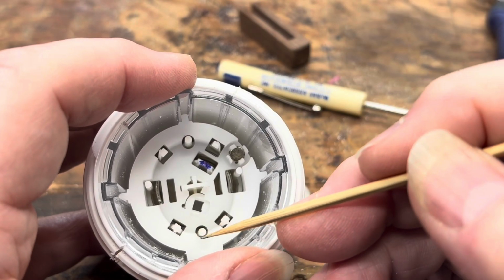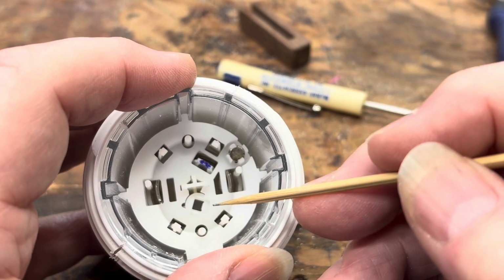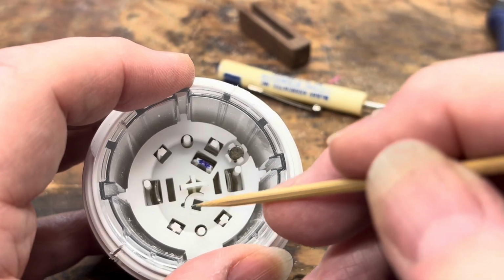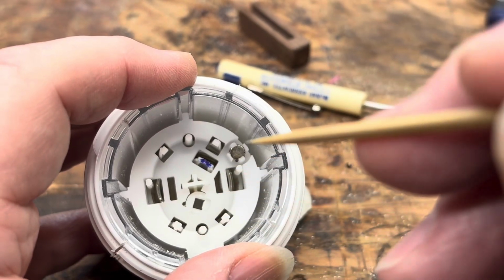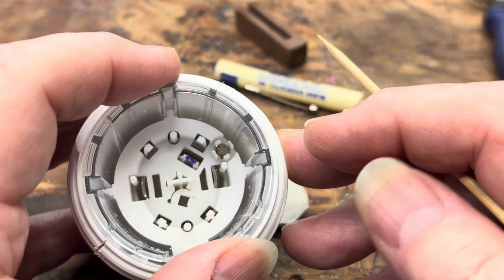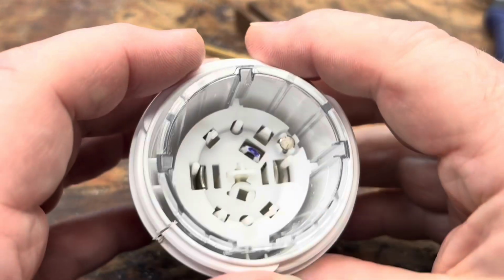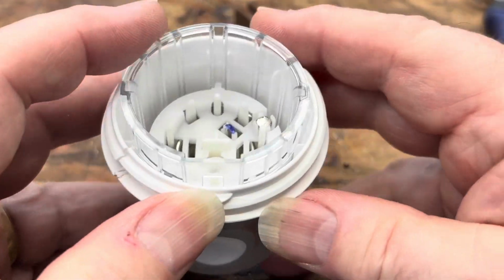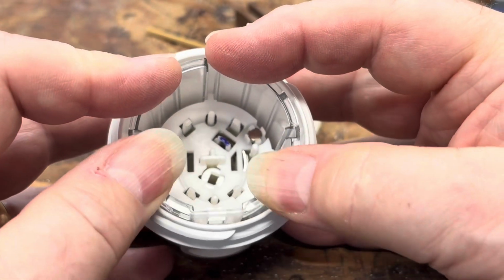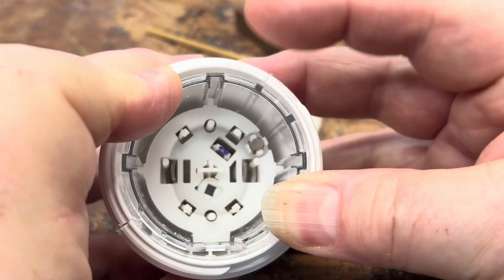Now that it's touching the patient's arm, we don't need to hold it in place anymore. By then, the needle has inserted the probe into the patient's arm, so we need to withdraw the needle. And then 4 shoots back into this cup assembly and latches so that the needle can't hurt anybody anymore. So now, let's pretend I've pushed the unit. The patient is pushing this against their arm. They're ready to push the trigger, and this all happens very quickly.